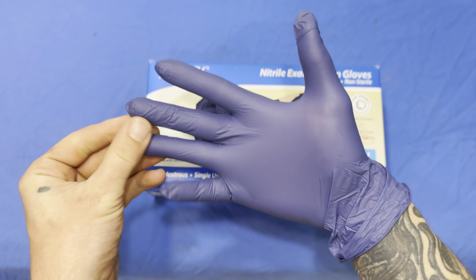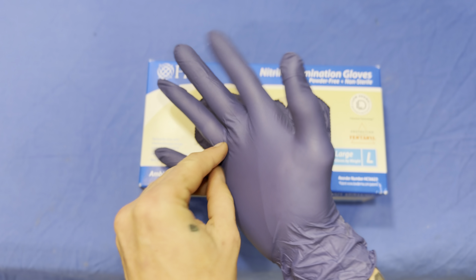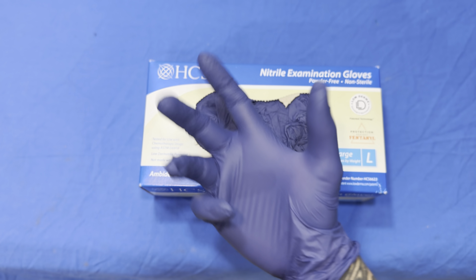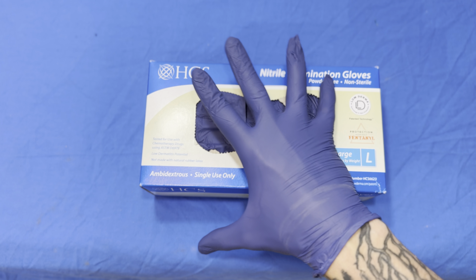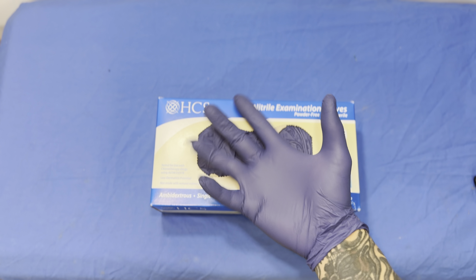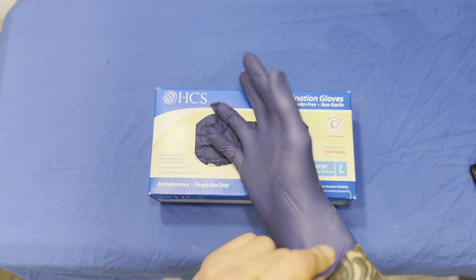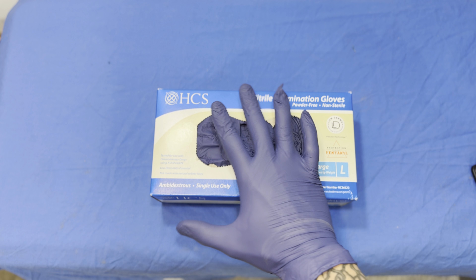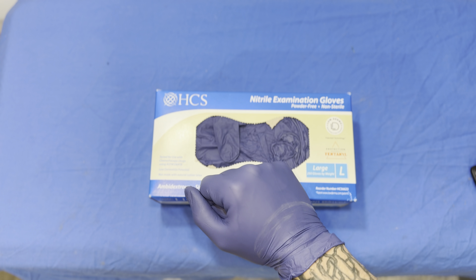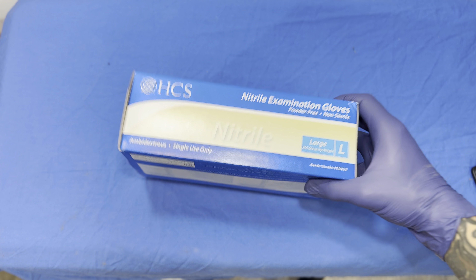This is a really nice fit — they're easy to pull down on the skin and they don't get too stuck. These are powder-free gloves, but they go on just fine. They've got a bit of a blue hue to them, a really dark blue. It kind of looks purple here but it's dark blue — that's just the lighting.